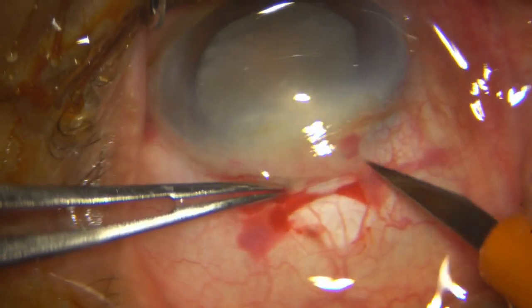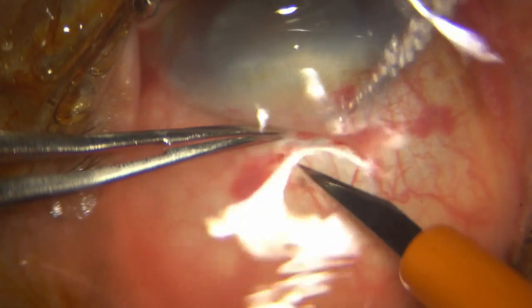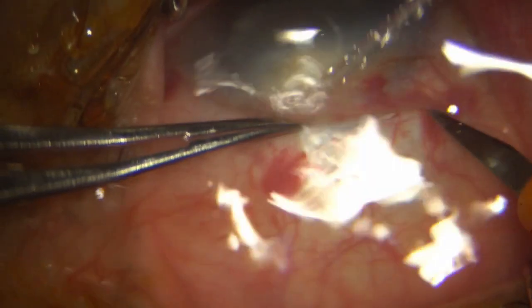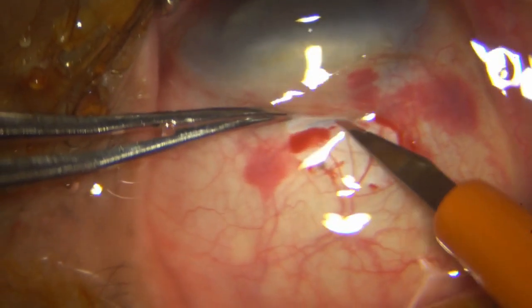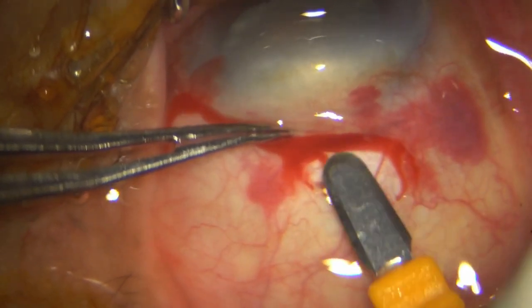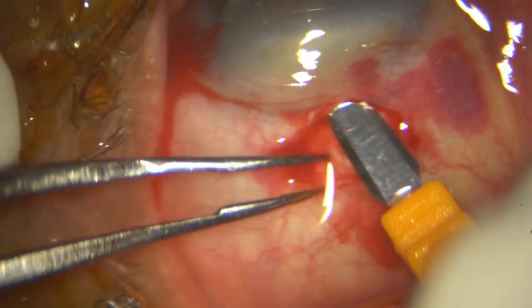So under irrigation, I just increase the depth, and this is a tricky area. You really have to go in the same groove. Having done that, you can already see that this is excessively bleeding. However, the beauty of this surgery is it doesn't matter. Let it bleed as much as it wants. It's only going to bleed out.